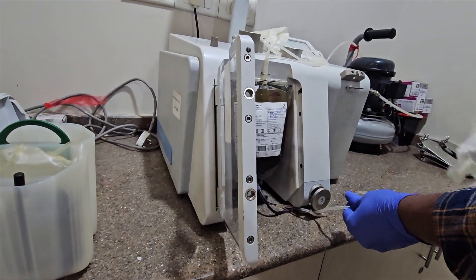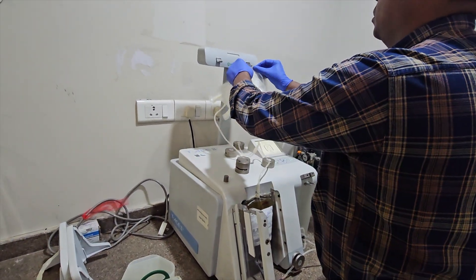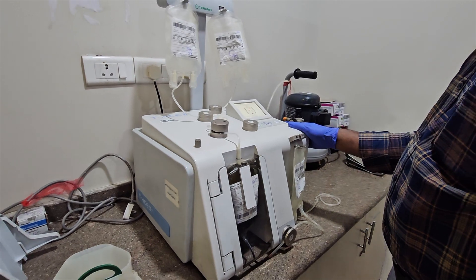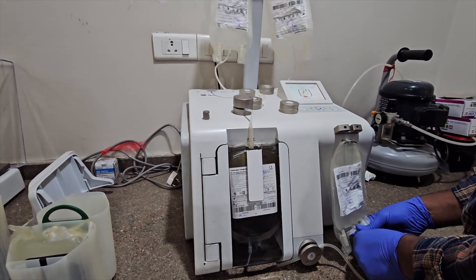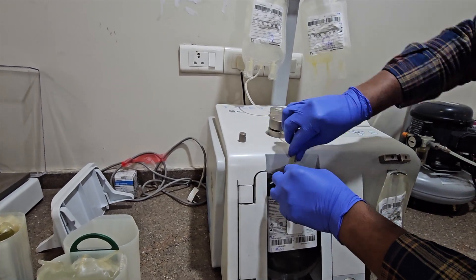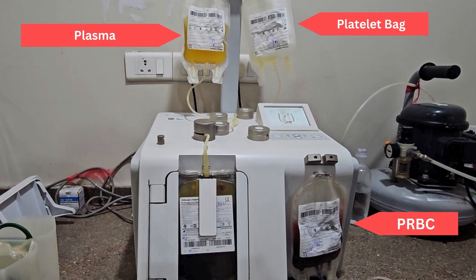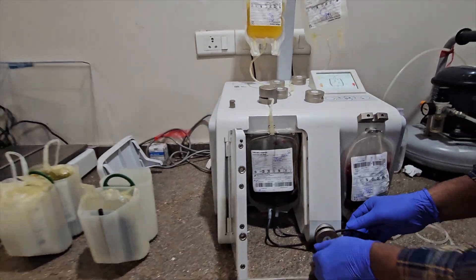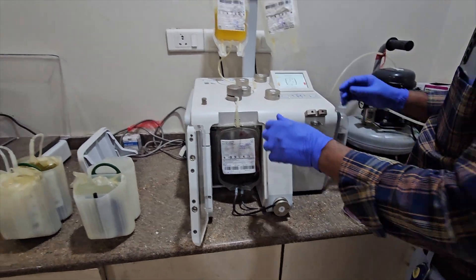The bags are attached to the automatic component extractor. The seals are broken so as to collect the components in three bags. The pure RBC and plasma are separated.